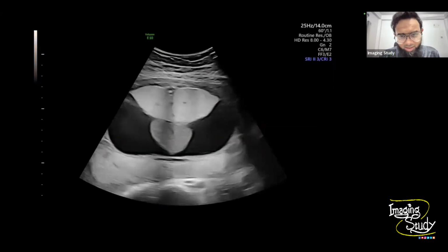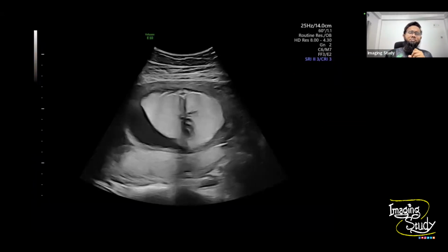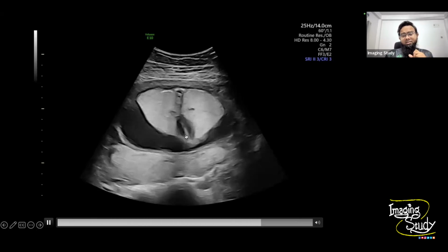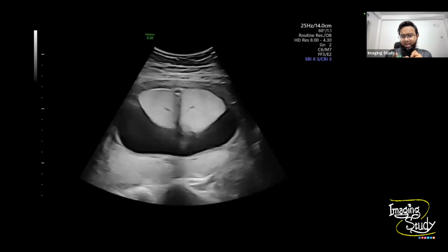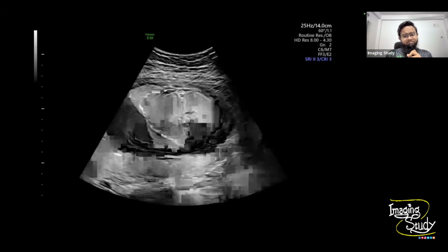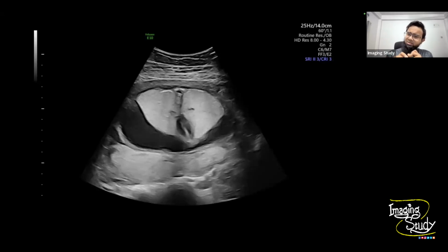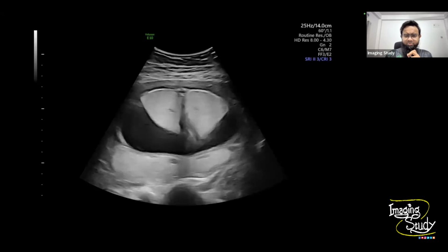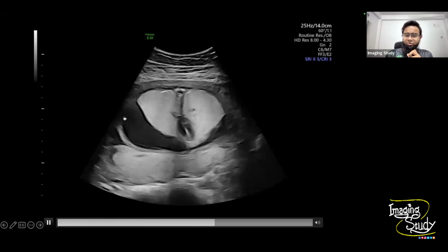Okay, so let's see it again. Now you can see this is a big chunk of lungs, and the heart is compressed, centrally placed, and narrowed a little bit. I checked whether there is any abnormality within the heart. The heart is only compressed. There is no VSD or any other abnormality present. So this is the condition. This is not a good condition.